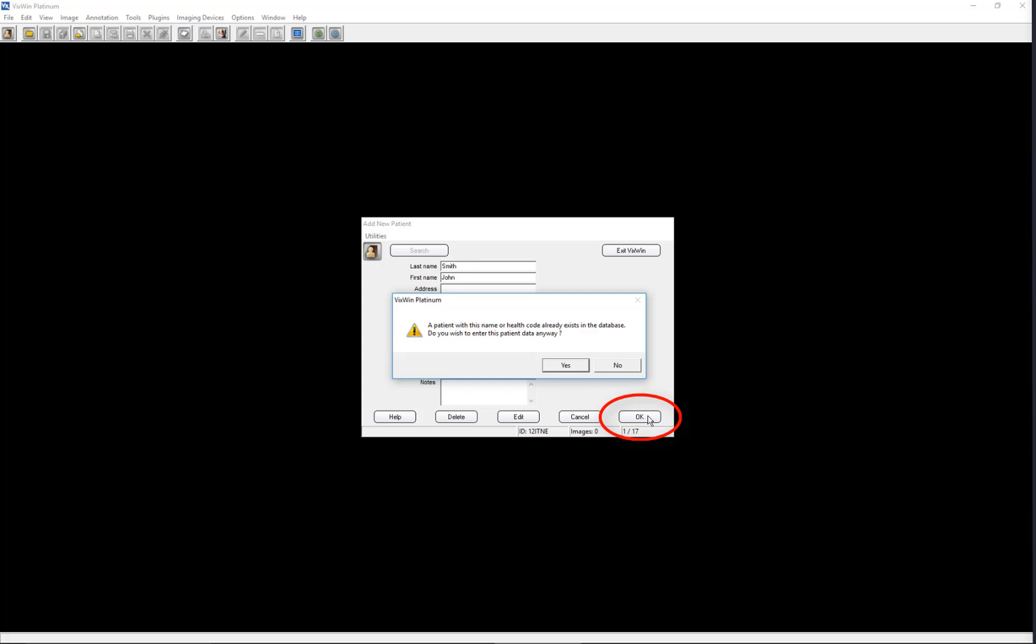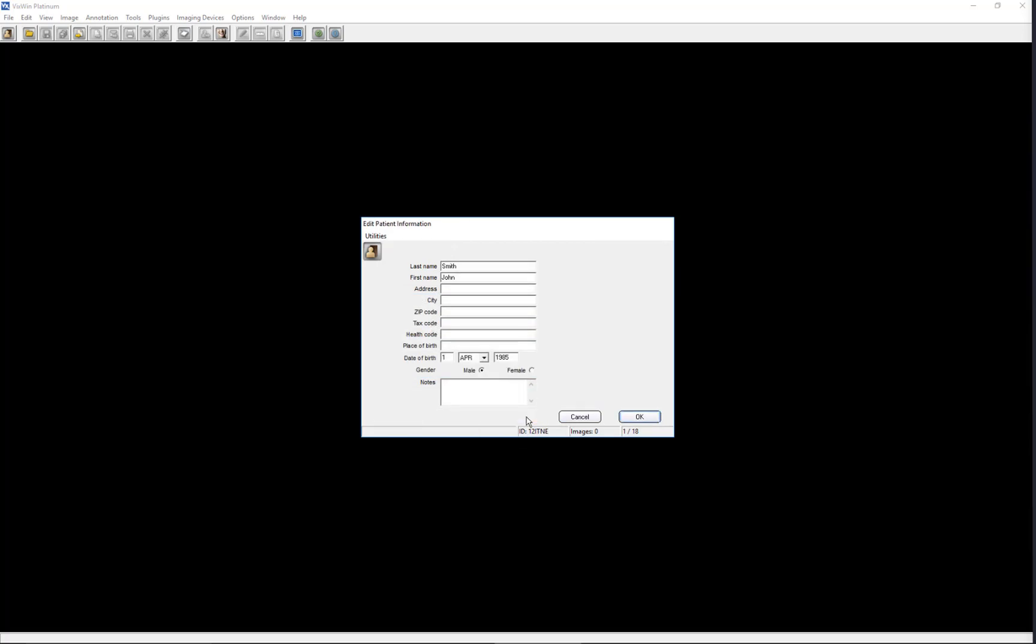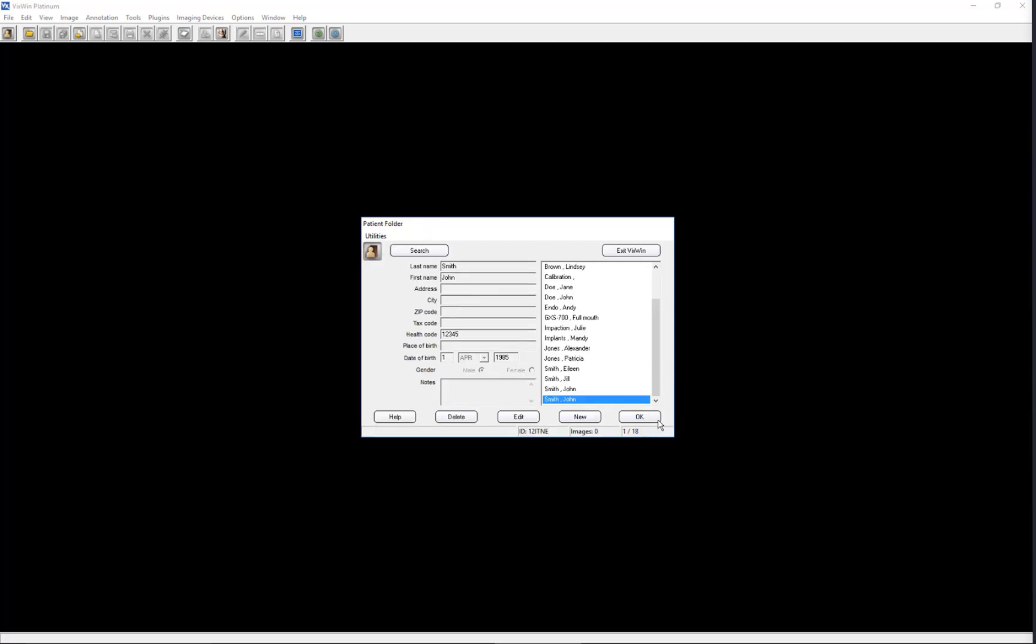The software will display a warning message when a patient's last name and first name and/or health code already exist in the database. Selecting No will cancel the data entry process and allow you to investigate whether the existing patient record is for the same person. If you are certain this is a new patient, click Yes, then click Edit. Here you can differentiate your patient from the existing patient by entering a differentiating fact in the database.